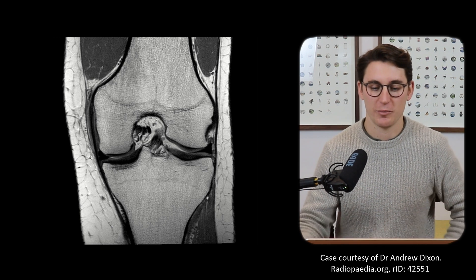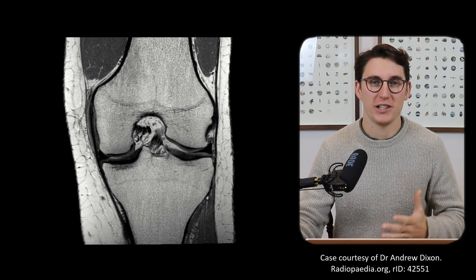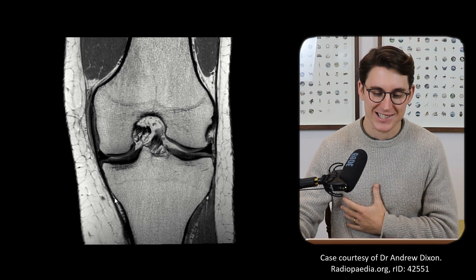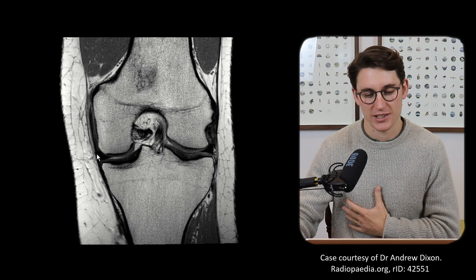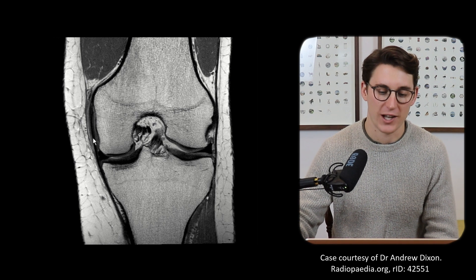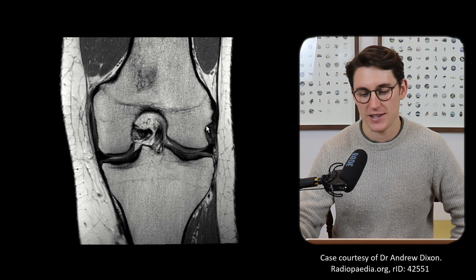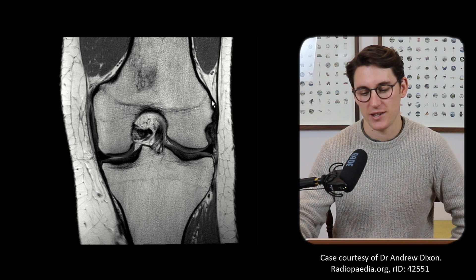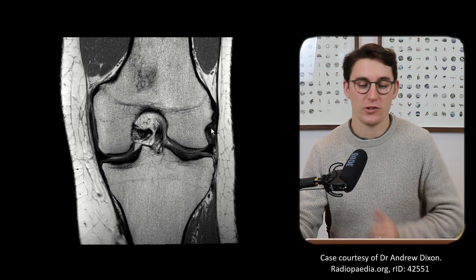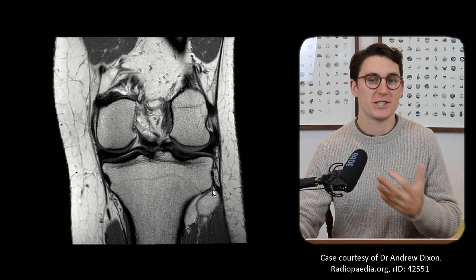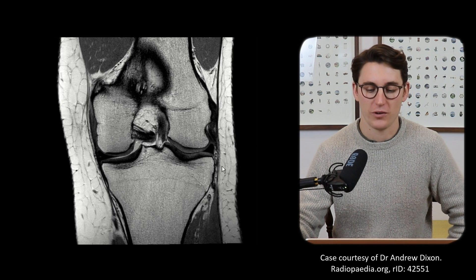Let's start by looking at this coronal PD image of the knee. The first thing we need to do is figure out which part of the image is medial and which is lateral. The first clue that this is medial is this thick, homogeneous low signal band coming down in close contact with the meniscus — this is the classic appearance of our medial collateral ligament. Scrolling slightly posterior, we can see almost the profile of a face — the classic appearance of the lateral posterior portion of our lateral femoral condyle. And when we see our fibula coming into the image, we can say confidently that this is the lateral portion.